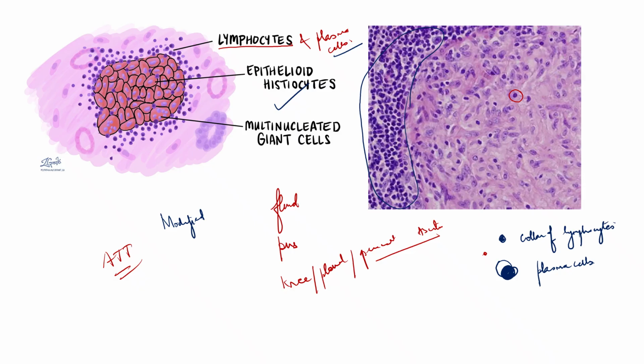We are not concerned with the site, that can be wrong, but if you see epithelioid cells and necrosis, just go for tuberculosis straight away as a suggestion, and then you can write a few other differential diagnoses if the site does not have a nice predilection for tuberculosis.